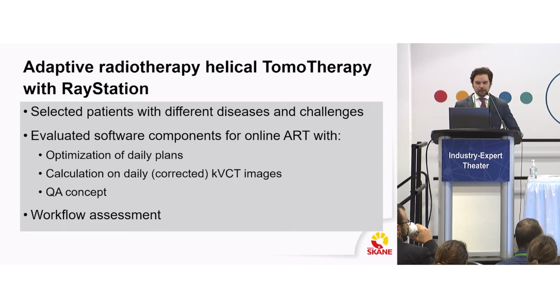So, adaptive radiotherapy then. We have selected patients with different disease and challenges, of course, and we evaluated the software with optimized daily plans on these corrected kVCT images done with the bulk density model. We also looked at some QA concepts similar to what Raphael showed and did a workflow assessment on this.